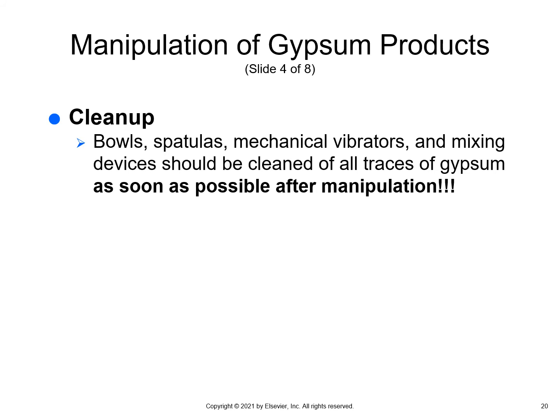For cleanup with gypsum, it is very important that as soon as you're done pouring up your stone model, you dispose of the excess in the trash because it will clog sinks. And then you rinse the residue with lots of water down the drain.